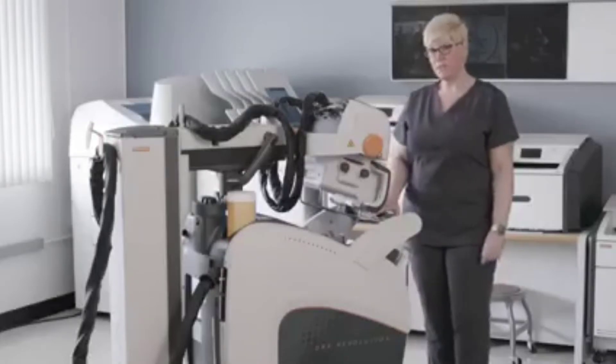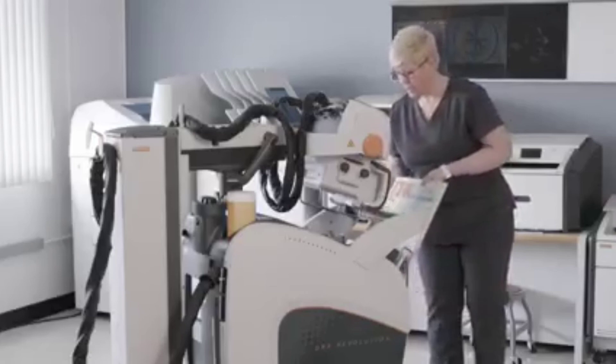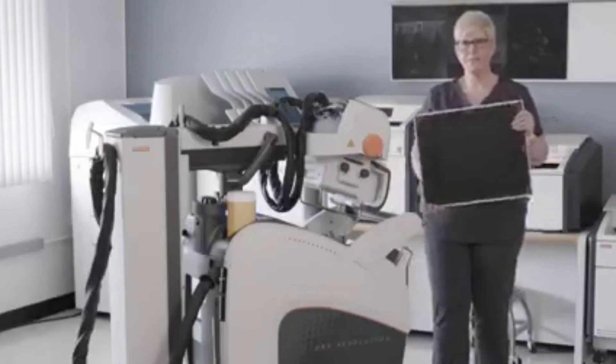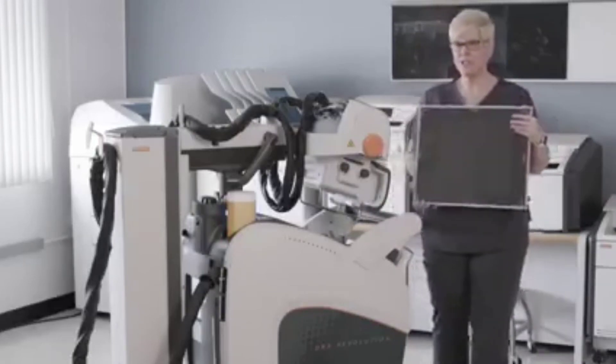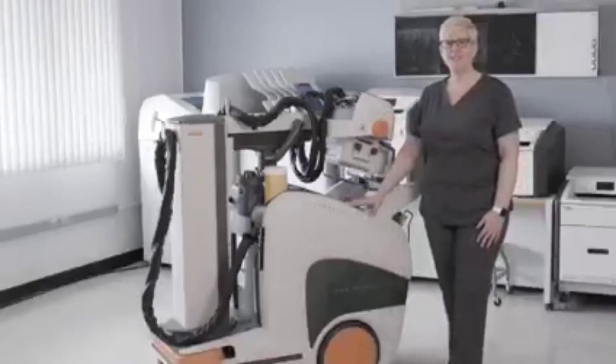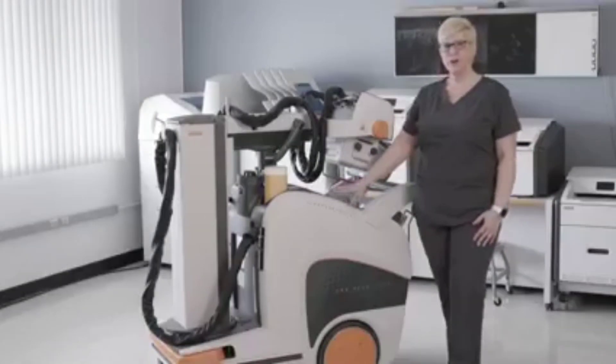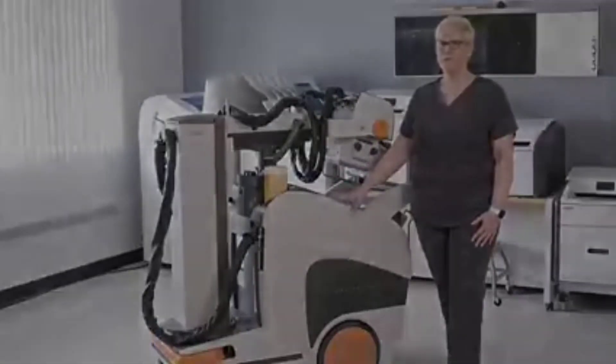The CareStream DRX Revolution system is powered by our DRX Plus detectors. These detectors support X-Factor and allow you to quickly share detectors throughout your facility. We at CareStream continue to listen to the voices of our customers when making redesigns and changes to our product. We hope that the changes we have made help improve your day-to-day workflow going forward.